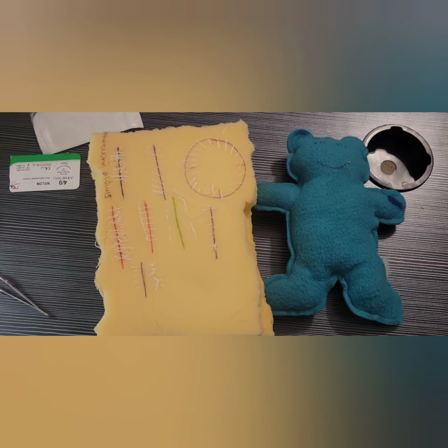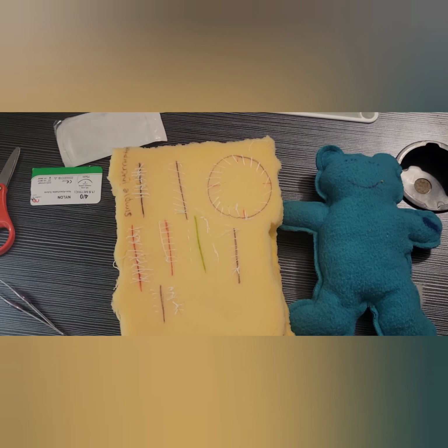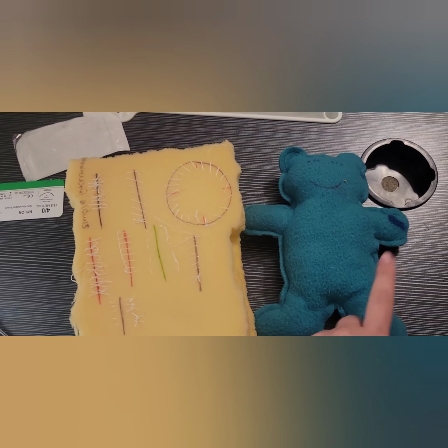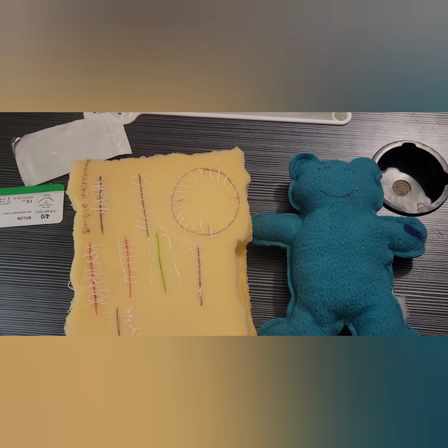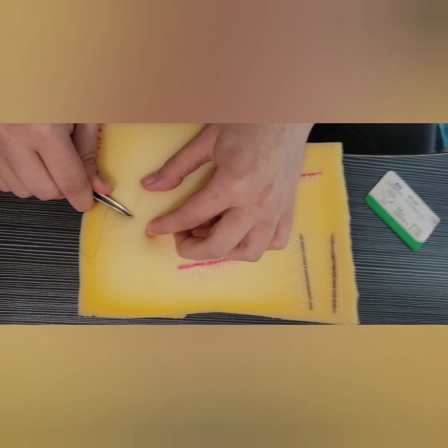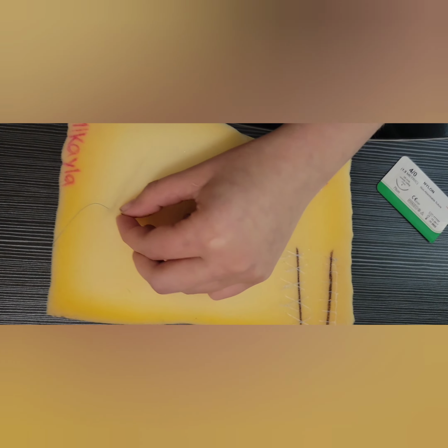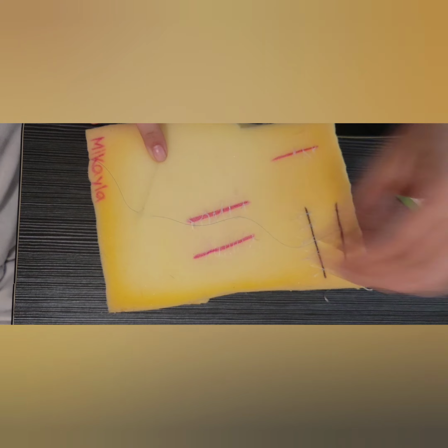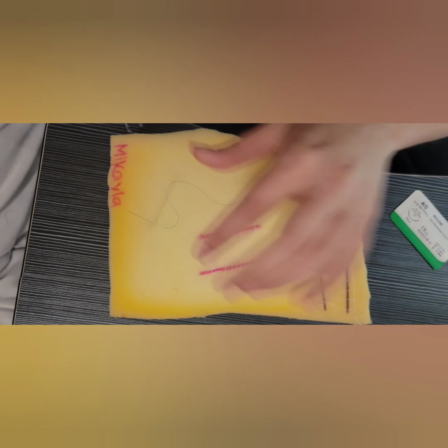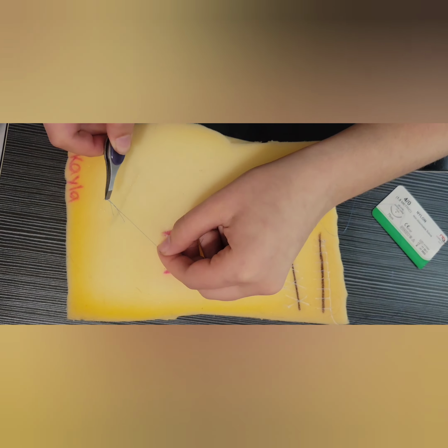For this first suture, I'm going to be showing the simple interrupted. These are just examples that I've done during class, and for the purpose of this video I'm just going to be using this little stuffed animal to show you the examples on. Okay, quick little voiceover for these because the sound was very hard to hear. Basically you're just going to thread it through one side, out through the other, and then make a knot. You're going to do 3 knots to secure it, and that is how you do the simple interrupted stitch.